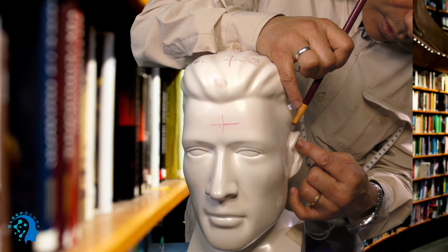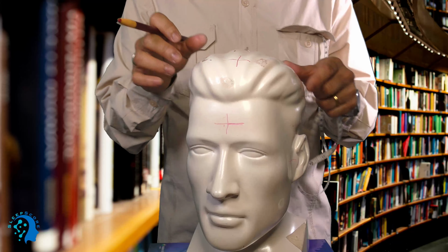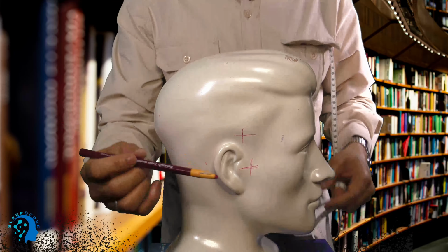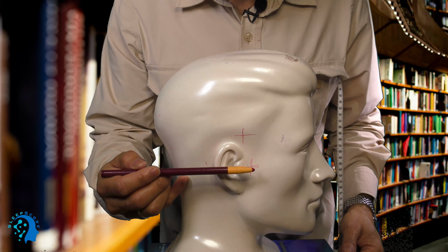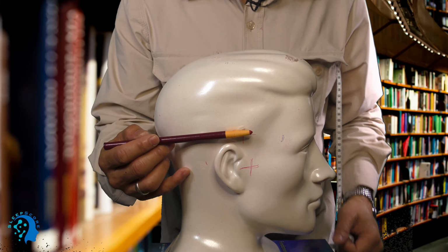Now I marked here 3.6. And this way you can check, this is pre-auricular, and you go up 10%, which is 3.6, and the other side also, you go up 10% from pre-auricular.